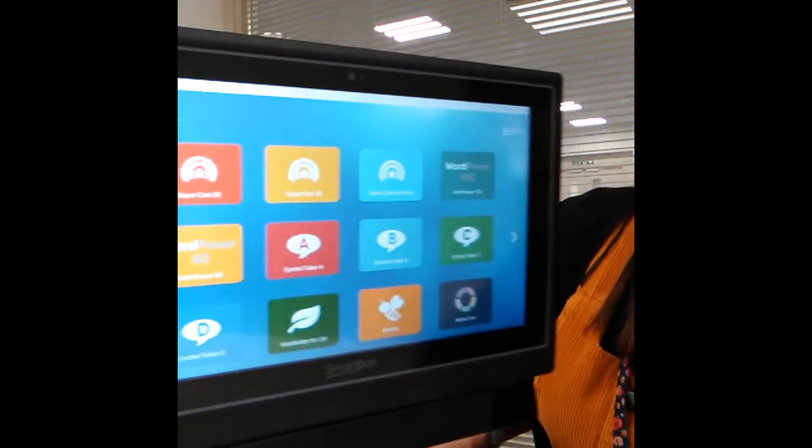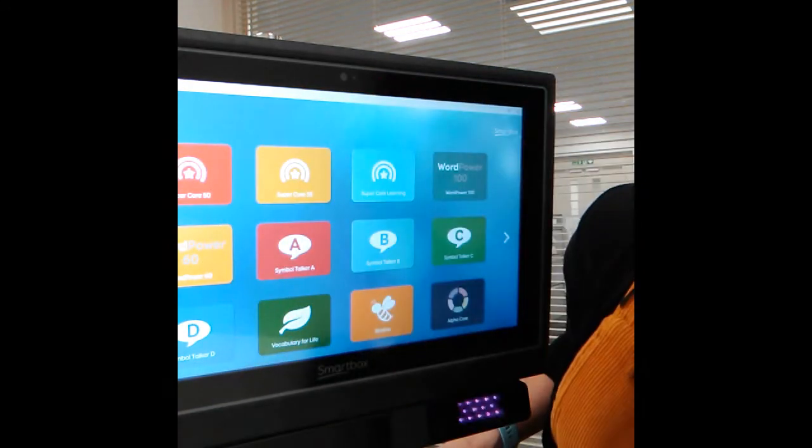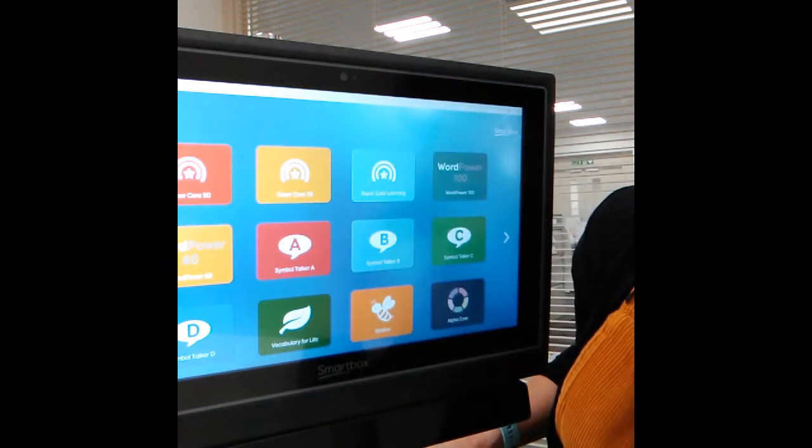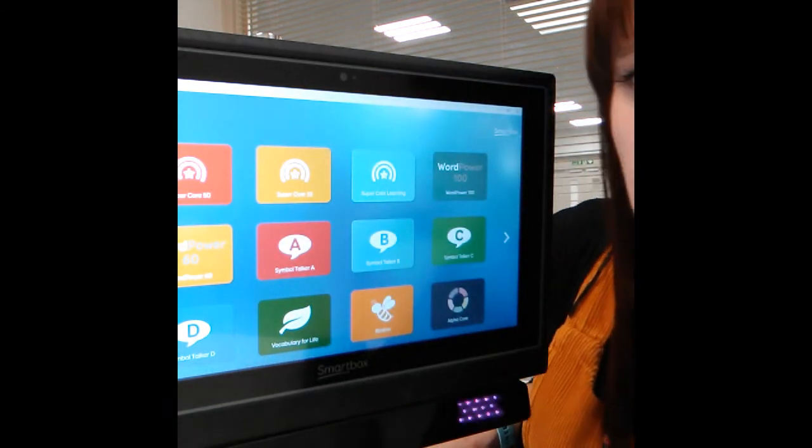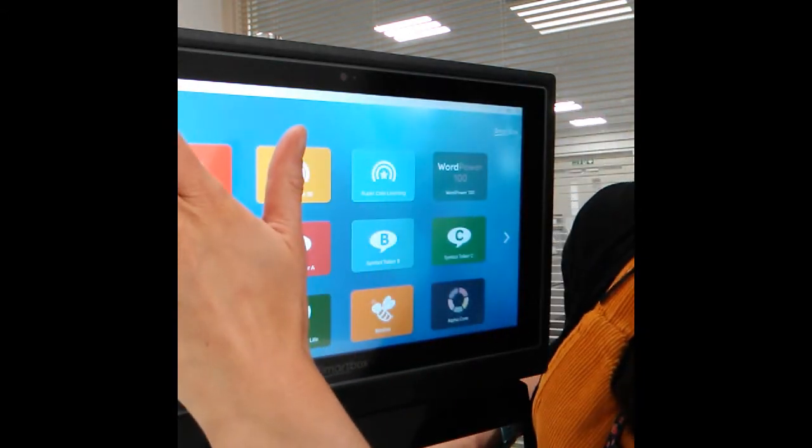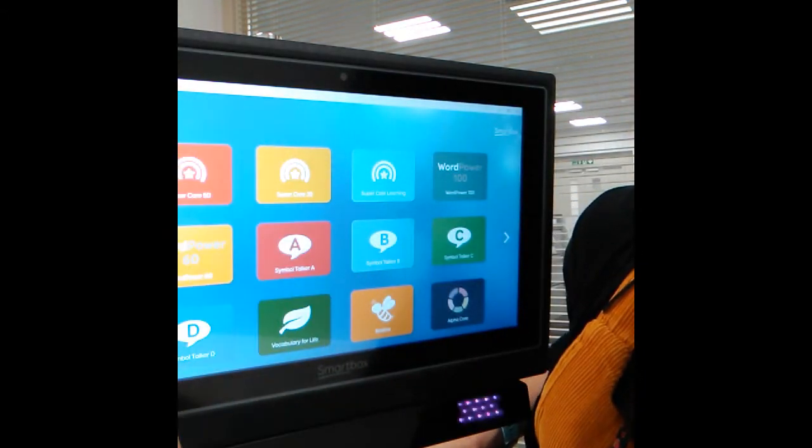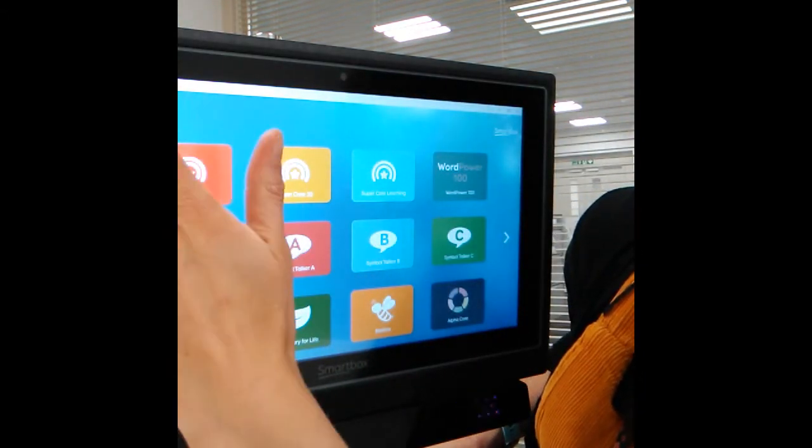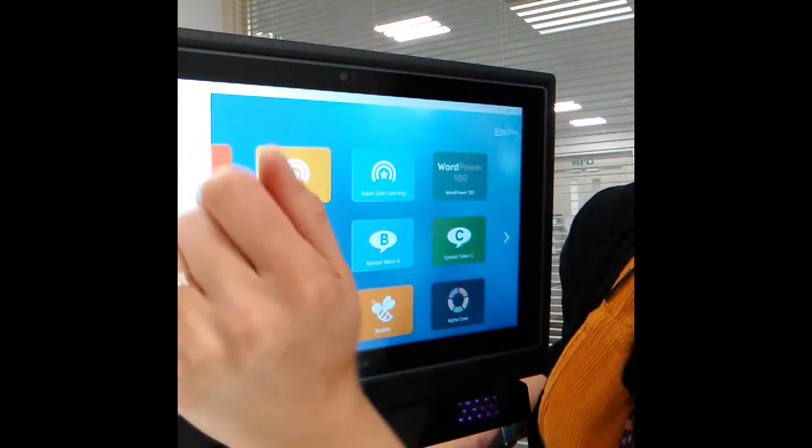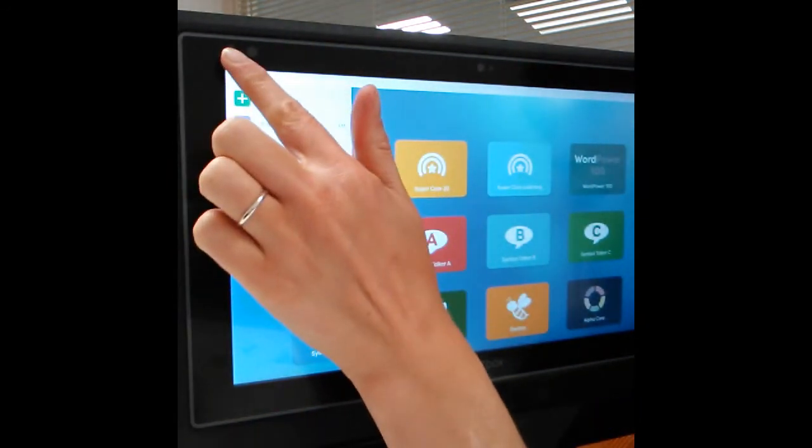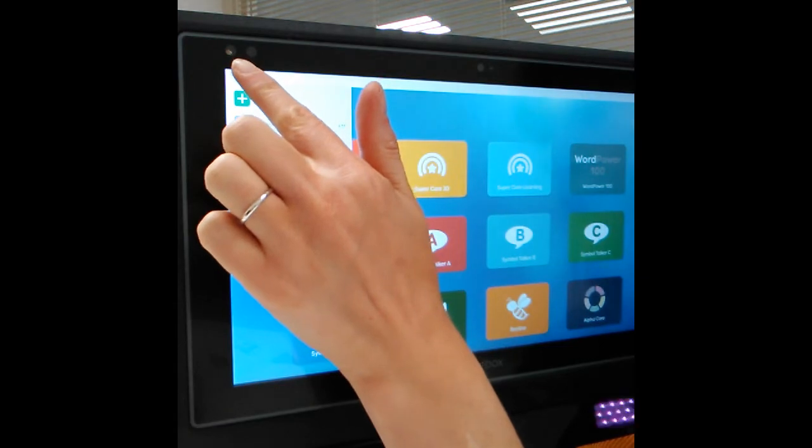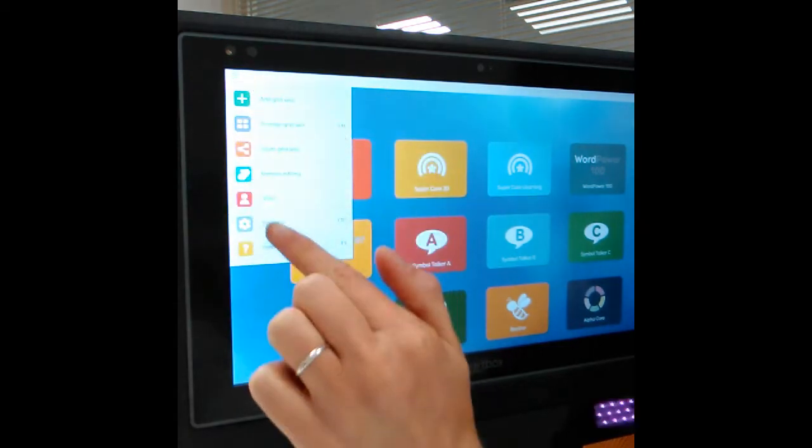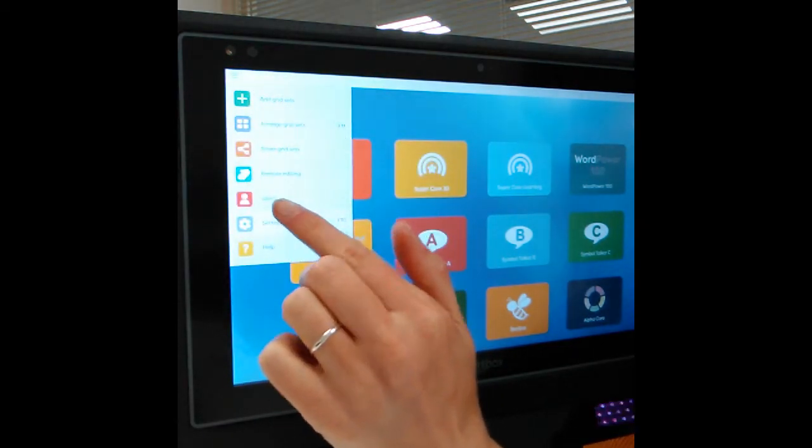What we need to do is go into settings in order to look at the calibration. If you select these three lines at the top and left of your screen and then go into settings.